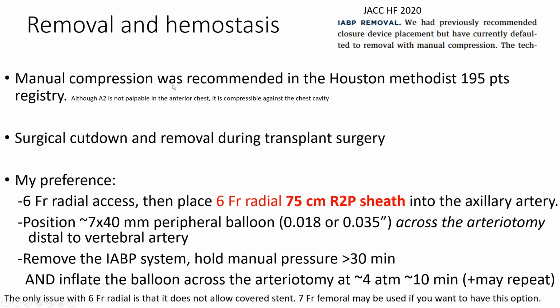Interestingly, the same group's original publication in 2013 had recommended a closure device, but in their 2020 larger series, it was recommended to use manual compression. Another option is surgical cut down and removal during transplant surgery. So those patients who are awaiting transplant, when they do get their transplant, at the end of the transplant surgery, the surgeon may remove it via cut down and close via cut down. But this is my preferred method for closure.